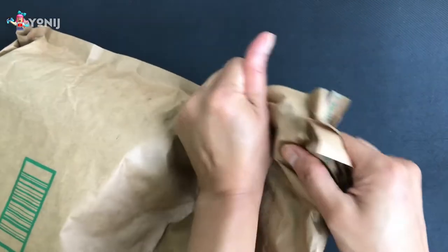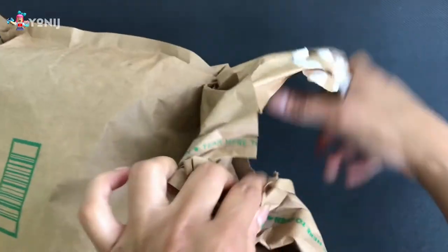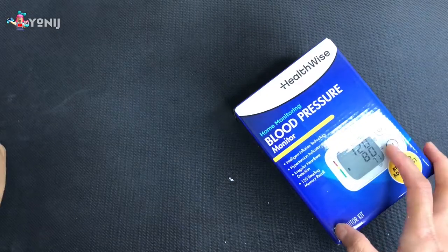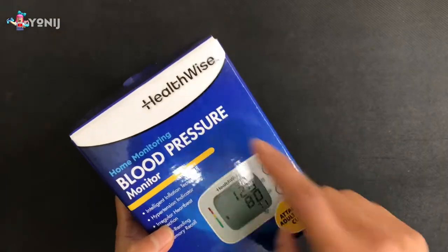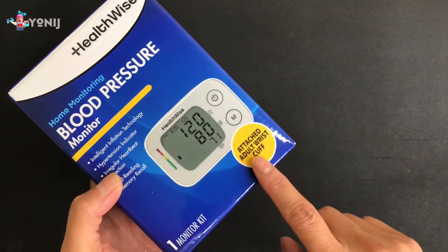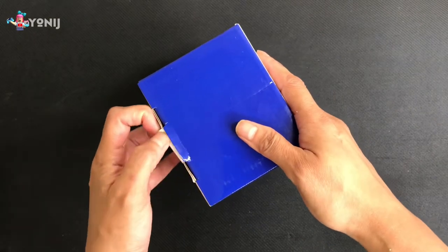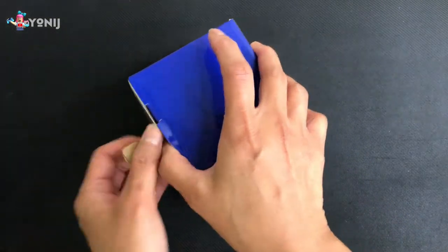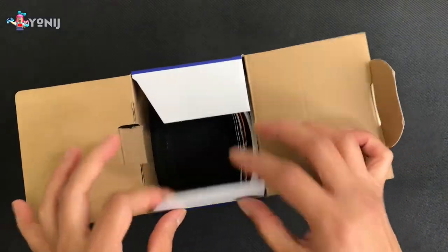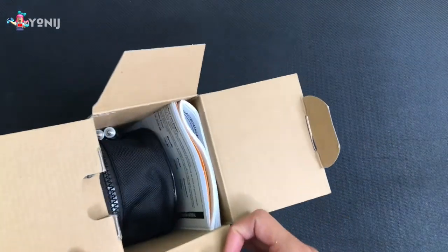Hey guys, we are back and today we'll be unboxing this item. You're gonna find out once I have it open — and there we go. Today we're gonna check out this Healthwise blood pressure monitor. This is the adult wrist cuff version, $29.99 on Amazon right now. This product came out in February of this year, February 2022, so it's technically not a year old yet.